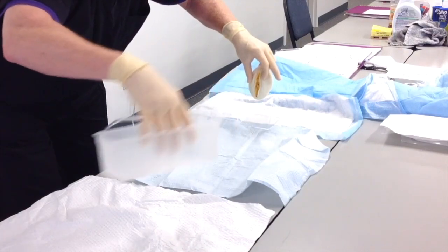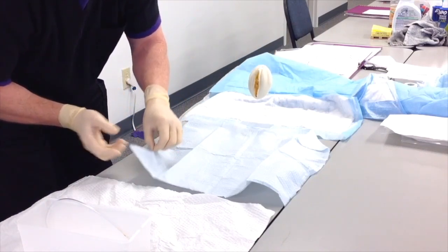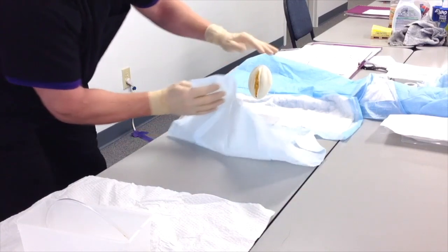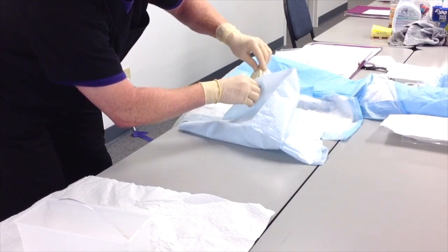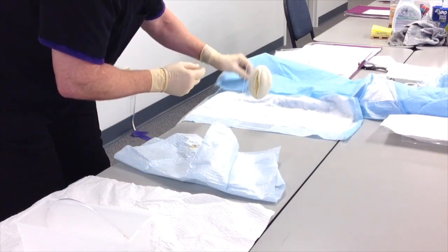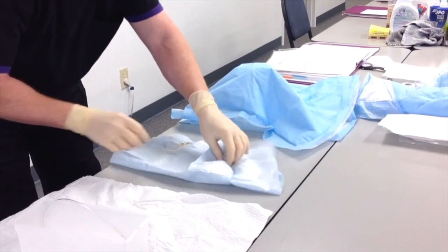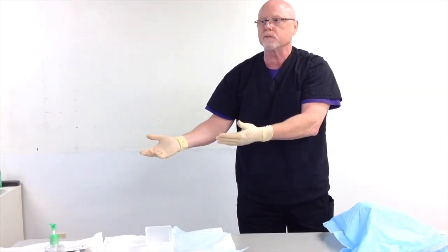lift this hand up right here, set this over here to the side like this right here, then you reach underneath and you take the drape that you used to rest the container on, and you reach up and you wipe the vagina from the top to the bottom, and then you redrape the patient. This, of course, would go in the trash can or wherever the receptacle is that they have.